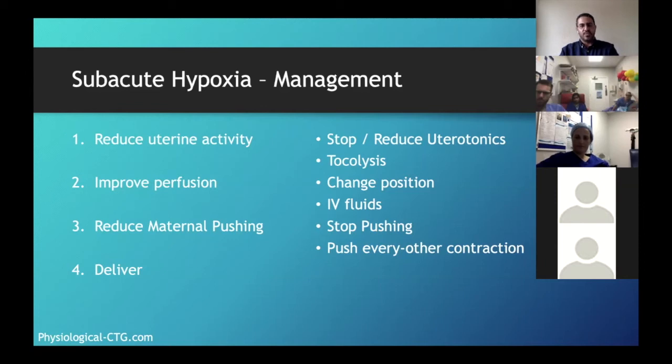That's not a problem. The first thing that you start noticing is that the baby is spending more time at the baseline. That's your first sign of improvement. And the variability that's super abnormal is either now only exaggerated, no flats anymore for a while, or actually getting back to normal. Does that make sense? Yeah.